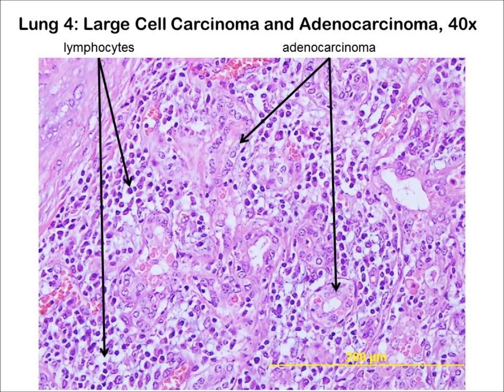Now scan the region around the smaller fragments of cartilage and locate the gland-like tissue that is probably adenocarcinomas. They form acini that are lined by a single layer of cells, and their lumens may contain mucin. Also note that they are surrounded by heavy infiltration of lymphocytes.